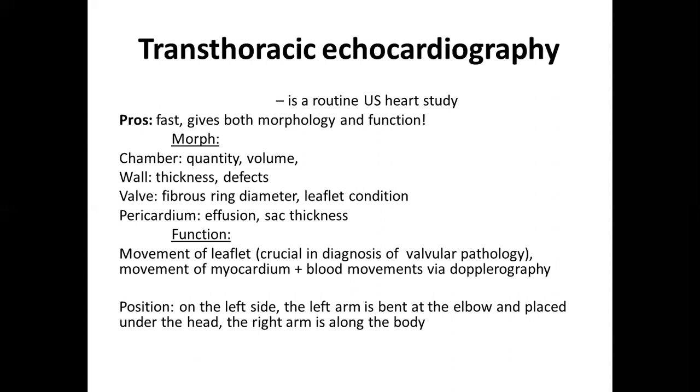We can check the fibrous ring diameter, its shape, the leaflet condition, whether we have incomplete closure because of sclerosis or calcifications of the leaflet due to chronic and repetitive inflammation in them, or some hereditary pathologies, or maybe some papillary muscle problem, or additional cords. So that is the whole valve structure.